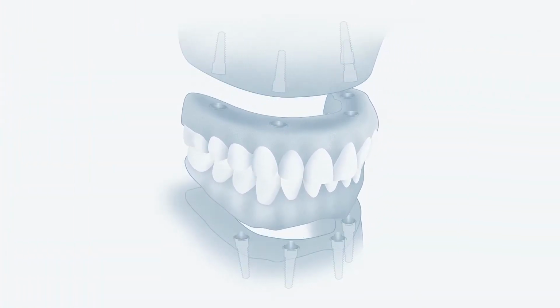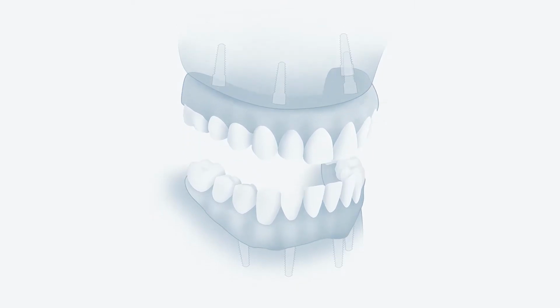An all-on-4 procedure is done in a scenario when there are multiple missing teeth, or the remaining teeth are in such a poor state in terms of the amount of bone loss they've had or the amount of decay they've had, that we are not able to restore them aesthetically and functionally. In those cases, an all-on-4 procedure is the best treatment option.